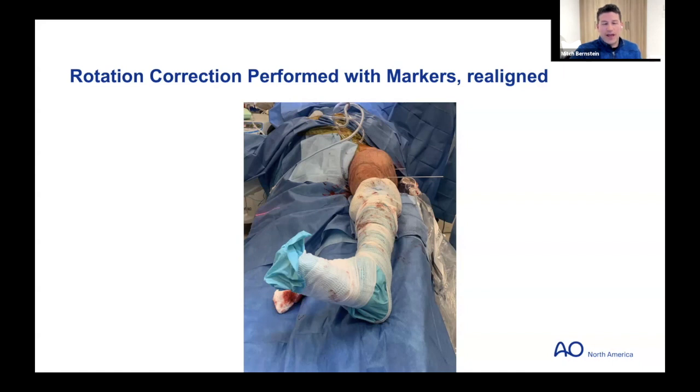If you are in any way concerned, seek out an open reduction. Doesn't mean you have to strip the bone. Seek out the open reduction, get it reduced, and look at my case. My patient needed a return to the OR, an adjacent level osteotomy. So did yours. That is a lot more morbid than an open reduction. And there's literature to support that a safe open reduction is good.